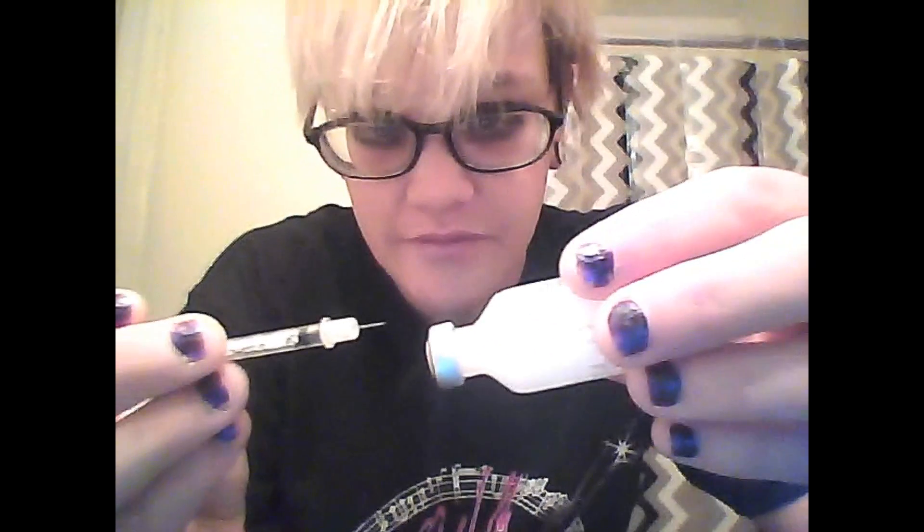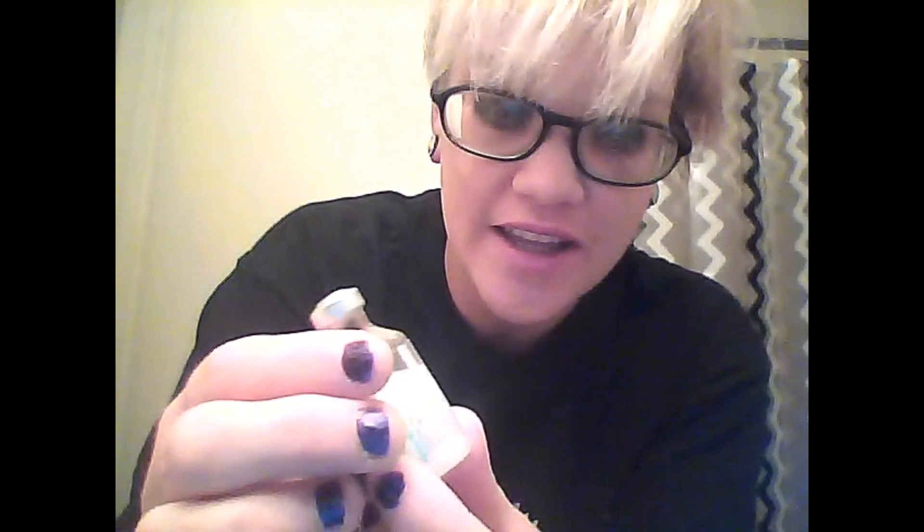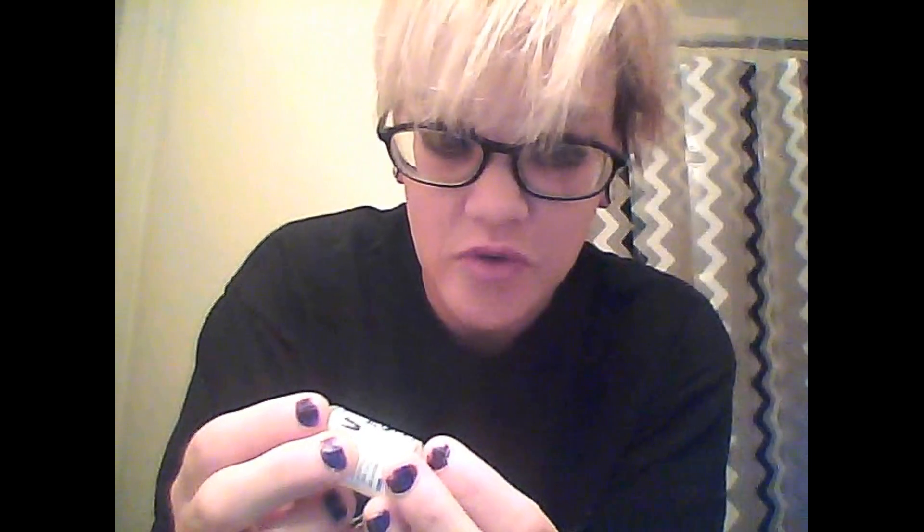One of the most important things I almost forgot — since the insulin is kind of milky, it settles when you don't use it. You have to roll it between your hands for about ten seconds to get it all mixed properly. There we go — it's mixed.